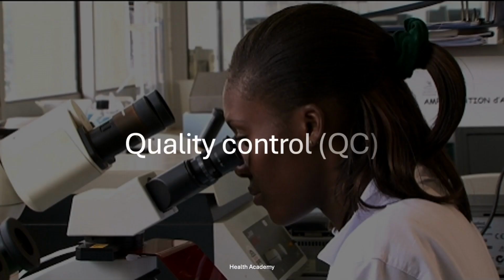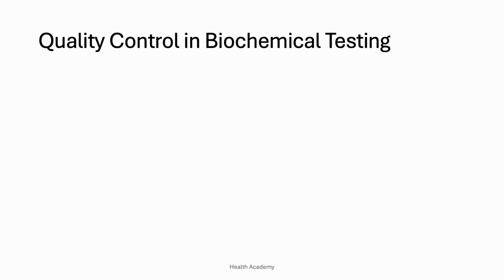Quality control. Quality control ensures laboratory results are reliable, accurate, and precise. Accuracy is the agreement between a measurement and the true value, with deviations pointing to systematic errors. Precision reflects the consistency of measurements with one another, with variations indicating random errors, assessed by standard deviation and percent coefficient of variation. Quality control in biochemical testing.